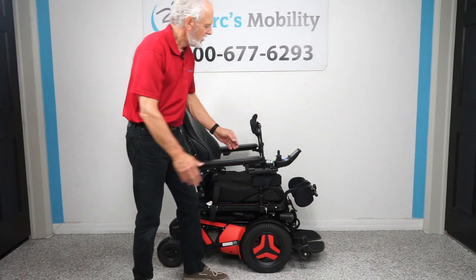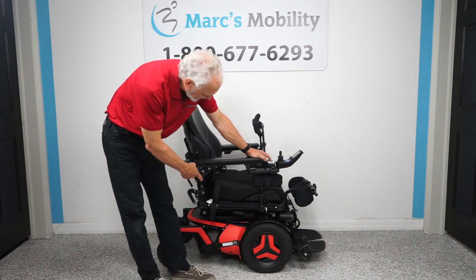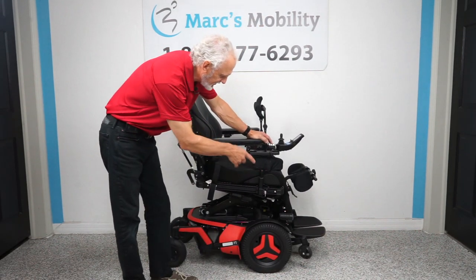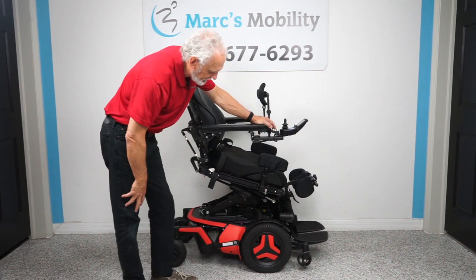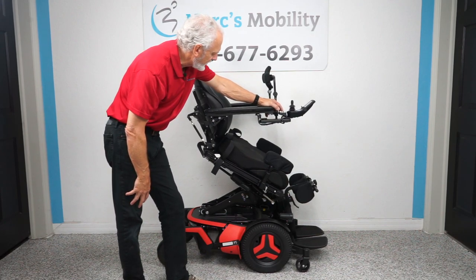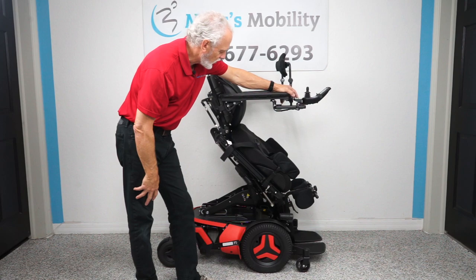You can use the joystick or a switch box. I'm going to use the switch box — it's a little quicker. If I hold the first button down you can see the seat starting to go up, and you'll also see these wheels in front going down. When the seat gets halfway up you'll see the wheels going down — that's to give you more stability during the standing feature. The standing feature is going up, and once you're standing you can still drive the chair.